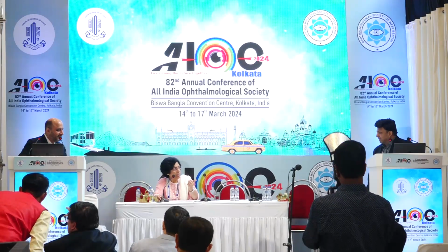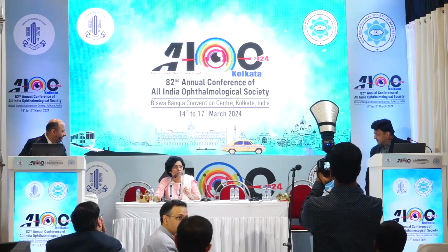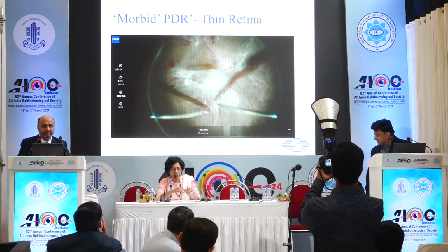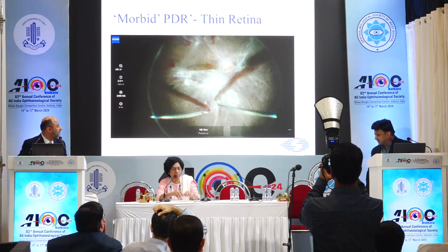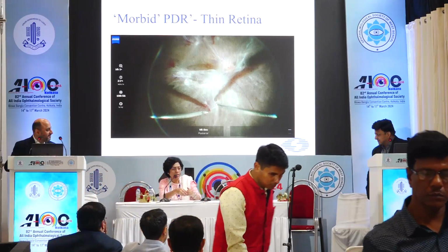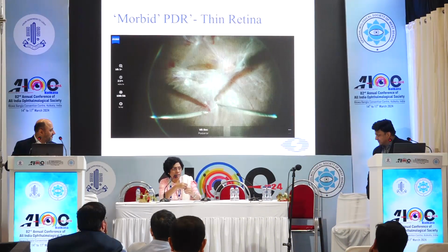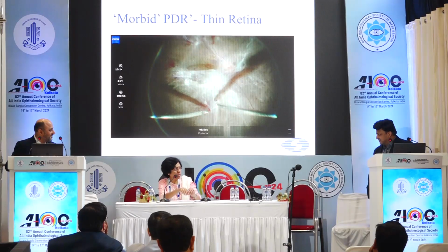So Sangeet's technique is also very good, but I just have one small criticism. Like Gagan also mentioned, there are often dense adhesions around the disc and a little bit outside the disc. In your video also you saw that there were some adhesions right next to the disc. Now the technique that you are doing is pulling it from the disc. I personally believe that at this stage of your experience, you know how much to pull and where to leave it, okay?